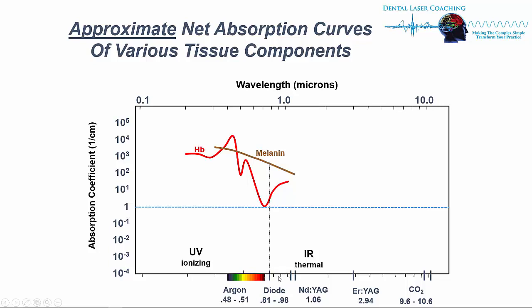As you can see here, the melanin and hemoglobin at 800, it's absorbing, it's above the baseline that we have here. And as we scoot over and get into the 980, it is even more absorbent with hemoglobin. As you go into the 980, it's less absorbent in the melanin, more absorbent in the hemoglobin. Now, just to note here, there are some charts out there that have oxygenated hemoglobin and things like calculus. I'm just going to keep to the basics here so that you get the idea.